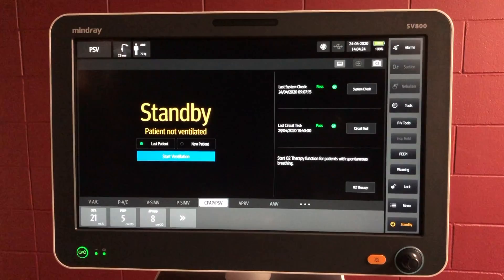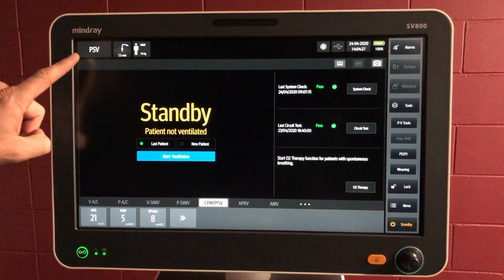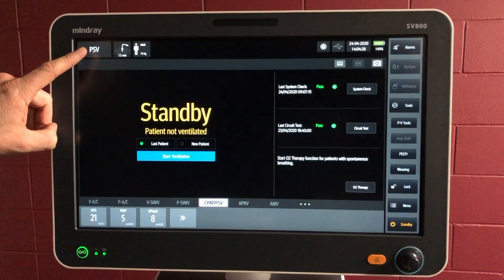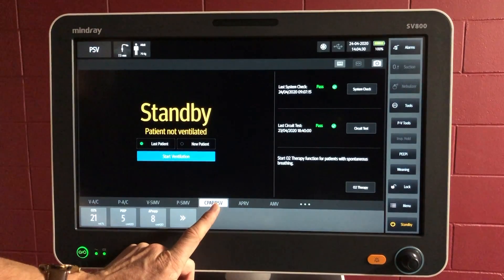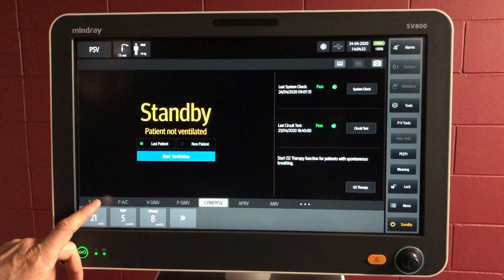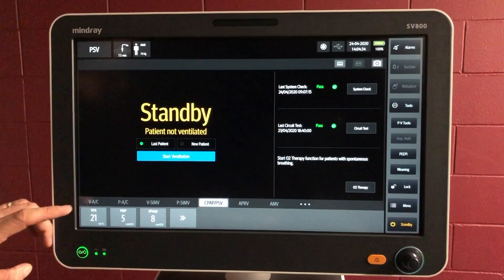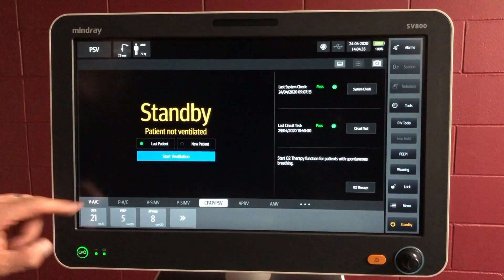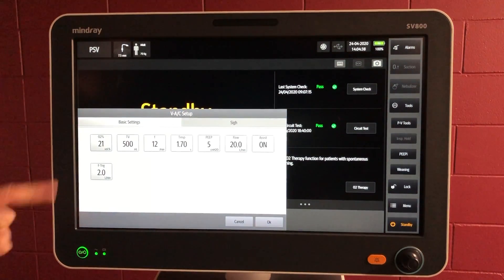The next thing is to choose which mode we're going to use. At the moment we're still in pressure support ventilation, CPAP with pressure support. Along the bottom you've got other modes available. Let's go with the volume mode — volume assist control.